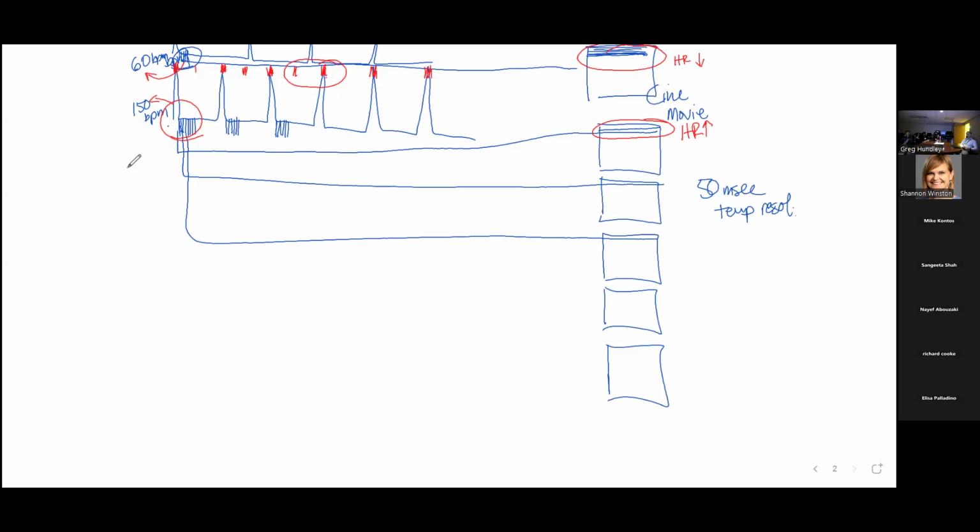All right. So this is nice because we can deal with slow heart rates and fast heart rates to make our movies. But does everybody show up with a regular heart rate? No. So we've got a new problem that we've got to manage.